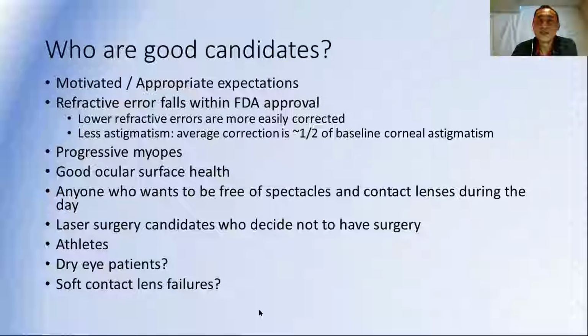I haven't seen any patients who have had problems just because they wore the lenses for X number of years. I myself have been wearing Ortho-K lenses for almost 20 years, and so far I don't seem to be having any problems, but we don't know long-term, 20, 30 years, if patients wear lenses for that long, if they will start having chronic problems because of Ortho-K treatment.